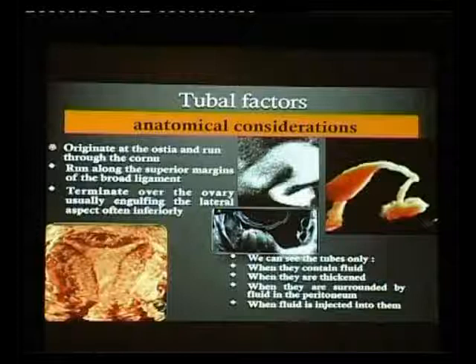And this is a huge variety of tubal pathologies, which could be post-inflammatory, there could be pyosalpinx, tuberculosis of course, and tubo-ovarian masses. Then we go into the myometrium.